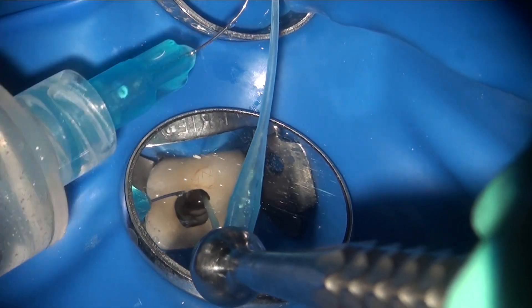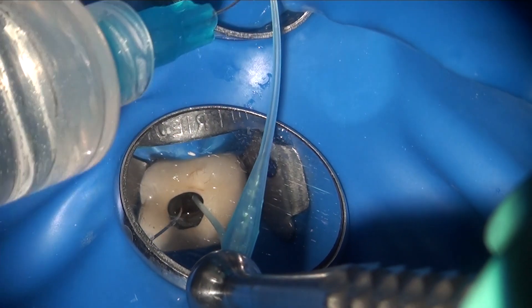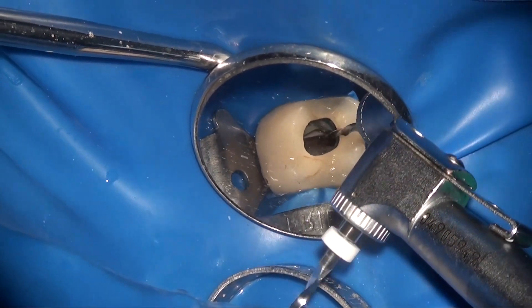Once the expediter — that's the 15/05 — is at the apex, each canal can be finished just like the basic protocol for ESX using a single ESX master file. We got a size 40 in the palatal canal and size 30s in the buccal canals with thorough irrigation. Just before cone fitting, another attempt at finding the MB2 was made.